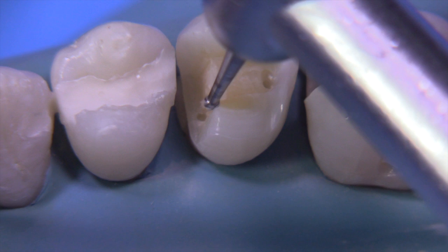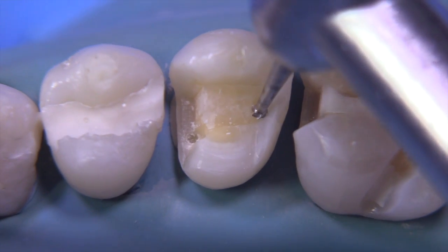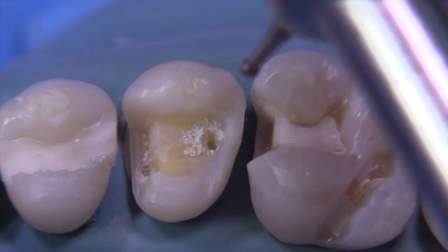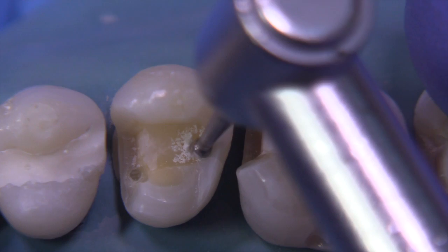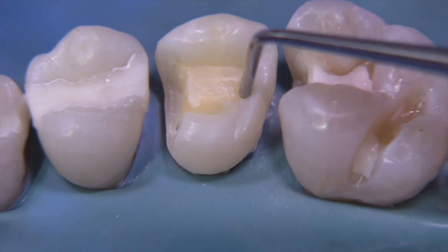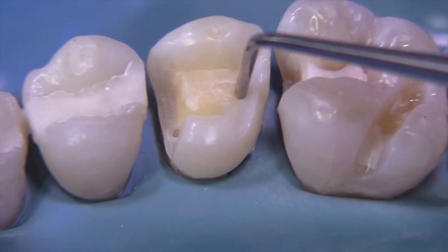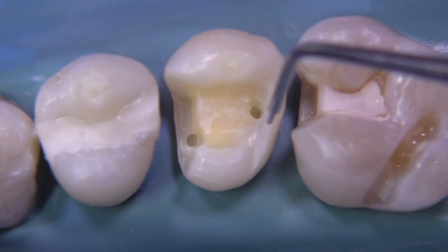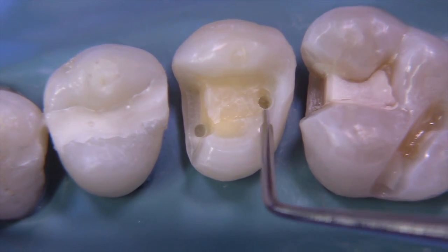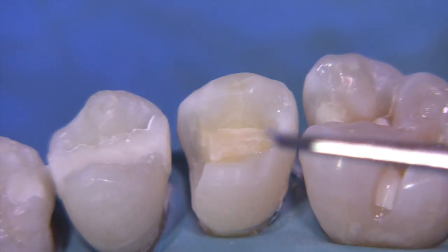Usually slow speed is the way I would do these, or electric — probably about 1,000 RPMs, really slow. And then we're now going to do the countersink on the occlusal pin or the pulpal wall pin — there's our four-round. Probably about half the distance of the bur would be about right. So let's measure: 1.5 millimeters here, and over here we're probably about 0.75, maybe a millimeter. So once again we have significant resistance and retention form on that occlusal pin, and then just enough resistance to keep this from rotating due to the lack of an excellent wall on the lingual.